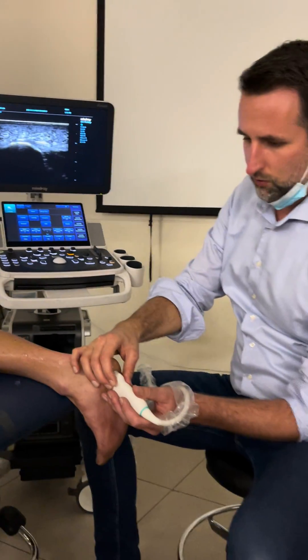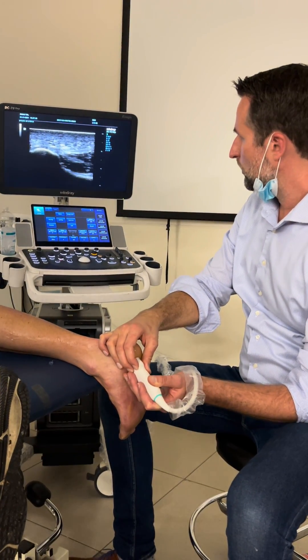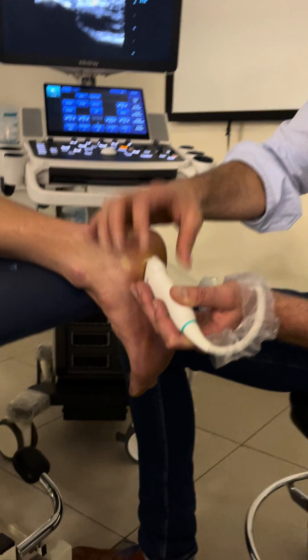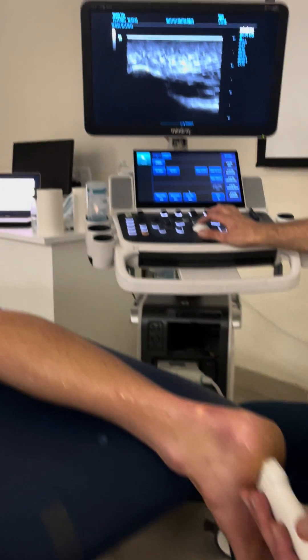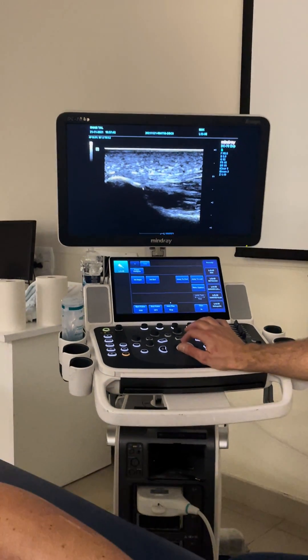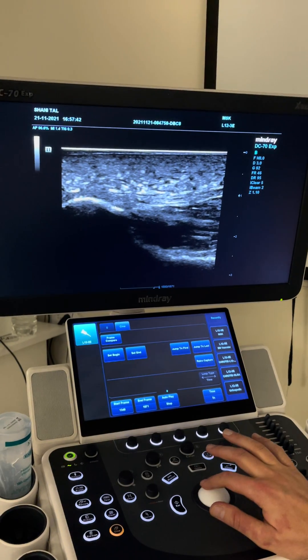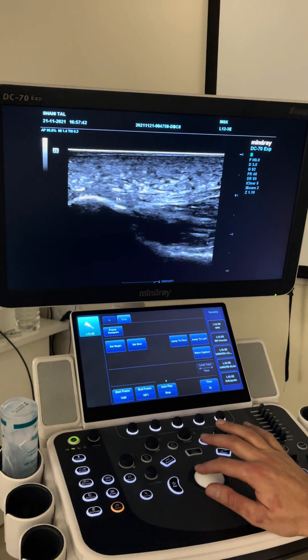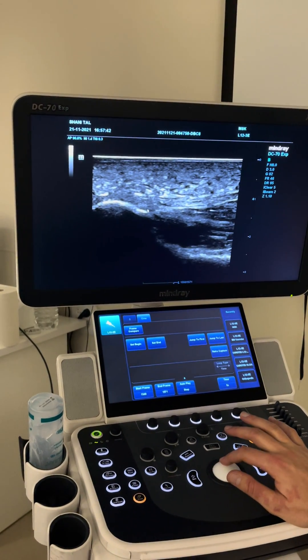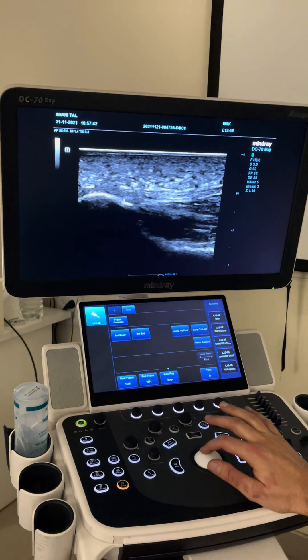That's the most important part for the settings. What we look for on this image is the calcaneal bone, right here — this is the calcaneus. The shape goes down here and then extends downwards, so it's normal to have a slight slope. If you have a heel spur, this will be a line that is exactly horizontal and then goes down very abruptly. In this case, there is no spurring.